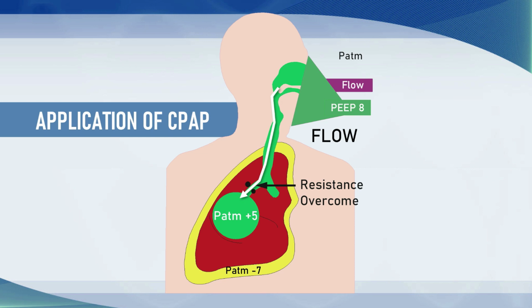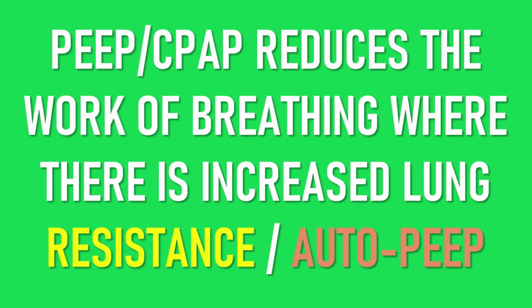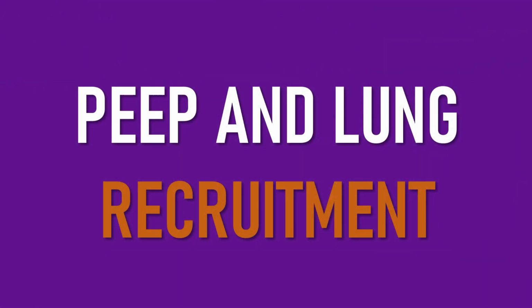And that's why CPAP is really effective as a treatment for Auto-PEEP and for airway resistance, because it reduces the workload of breathing and prevents persistent and increasing retention of gas within the alveoli. Now let's move on to a slightly different topic, PEEP and lung recruitment.